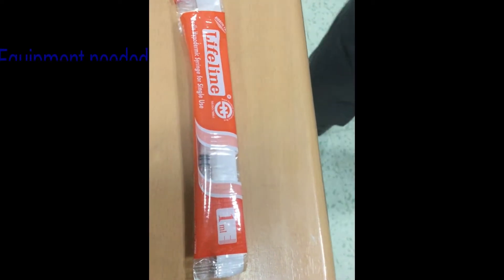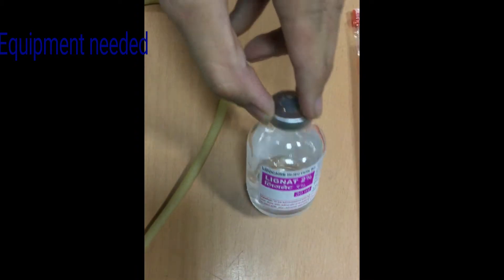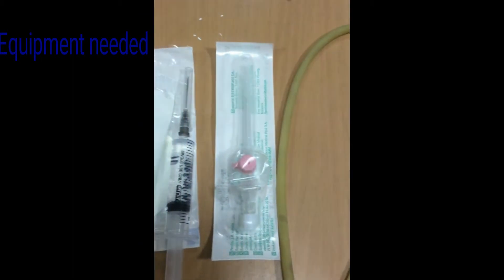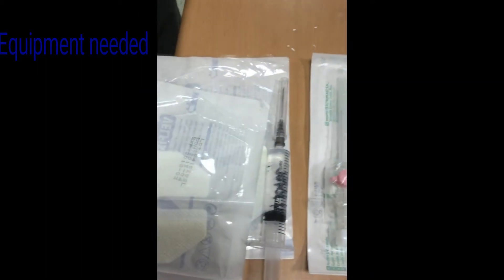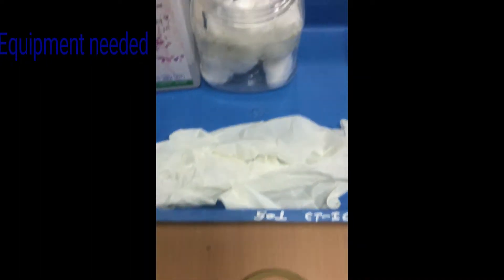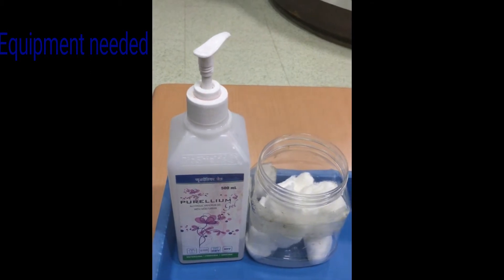Equipment needed for IV cannulation. If local anesthesia is to be used, a 1ml syringe and lignocaine 1-2% is needed. IV cannula of appropriate size. Flush in a 3-5ml syringe. Tape to fix the cannula. Clean gloves, cotton, and antiseptic spray.